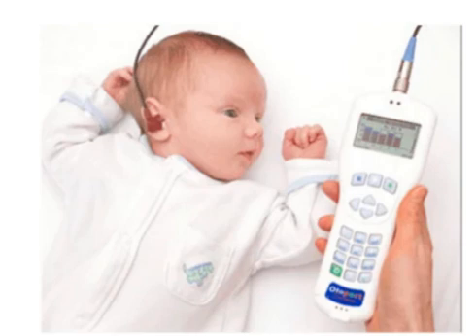Evoked otoacoustic emissions, EOAE, can be evoked utilizing three different acoustic stimuli: transient evoked, stimulus frequency, and distortion product. Transient evoked and distortion product otoacoustic emissions are the most commonly used techniques for a newborn hearing screening. Transient evoked OAE, TEOAE, are evoked using a click or tone burst stimuli. A click stimulus has an abrupt onset, short duration, and covers a broad frequency range up to 4 kHz to evoke responses from multiple nerve fibers.